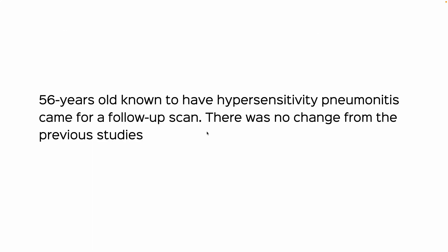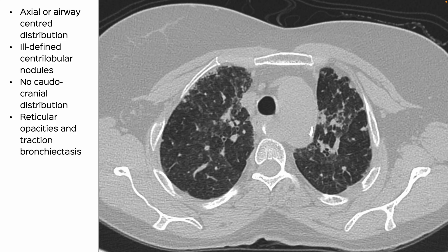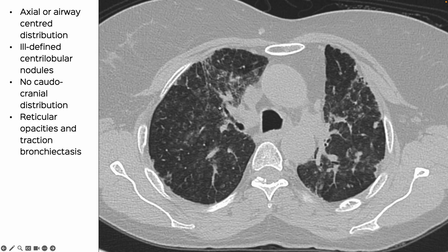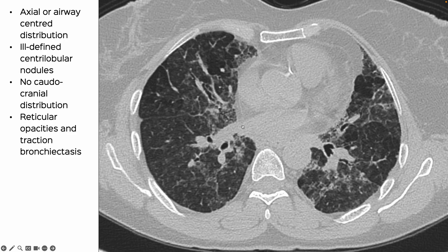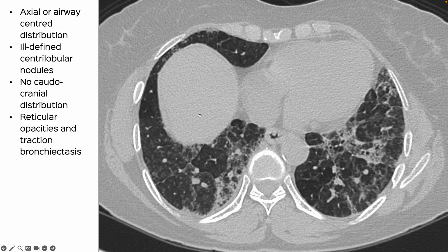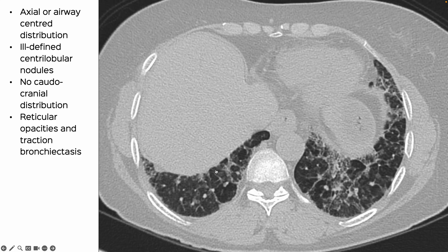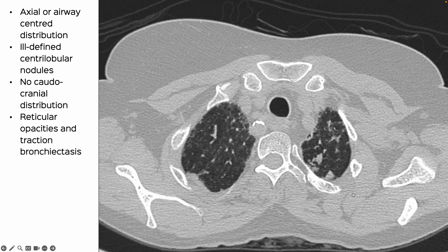This is a 56-year-old known to have hypersensitivity pneumonitis who came for a follow-up scan. There was no significant change from the previous studies. Using that new Ossirix tool to make videos, you can see these ill-defined centrilobular nodules, an axial peribronchovascular distribution pattern, the triple density sign here, and reticular opacities.